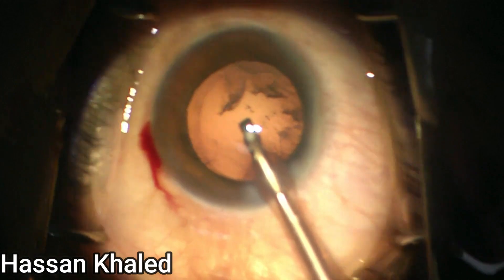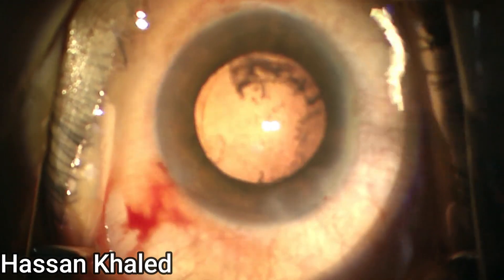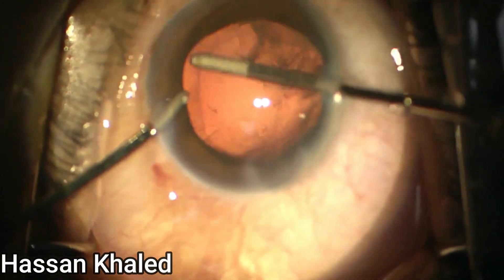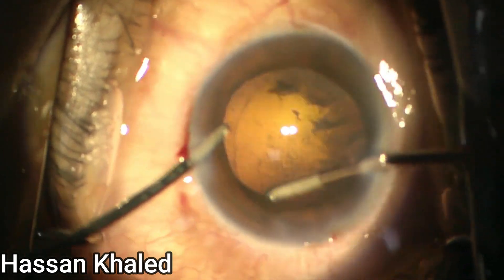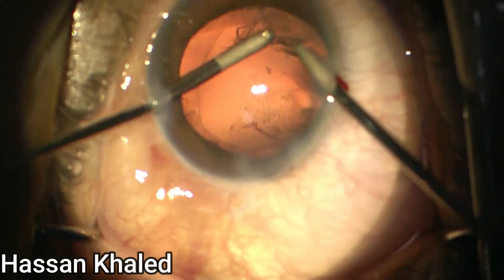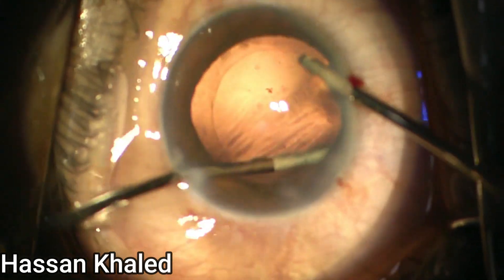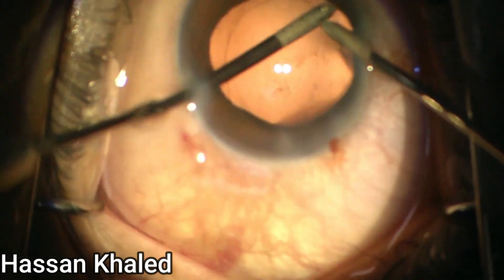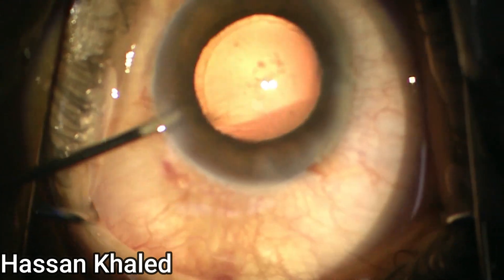Now the time of cortical removal — cortex washing using the bimanual irrigation aspiration. You can fix the eye with the irrigation probe and aspirate all the cortex matter. You can also twist the paracentesis with the irrigation probe to hold and keep the anterior chamber forming very well. You can see cleaning of all the cortex.